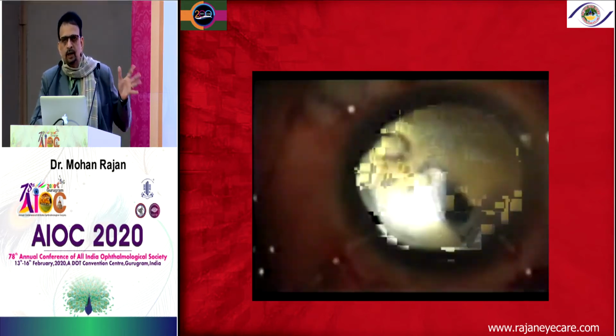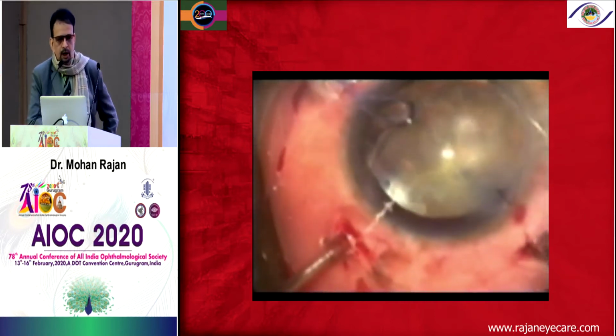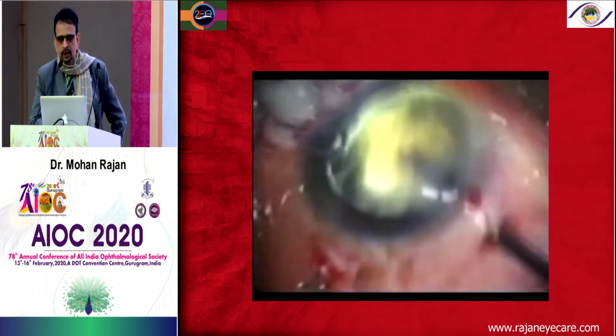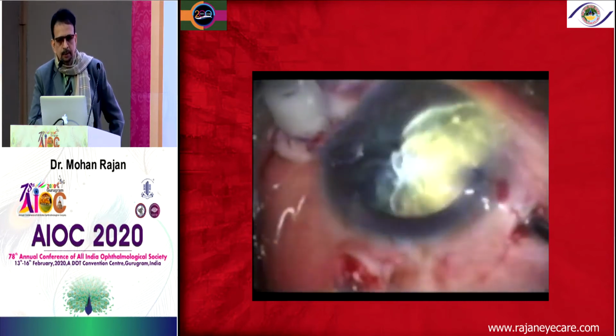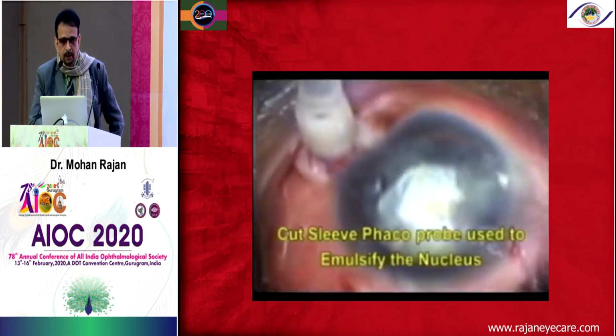If you are not trained in vitreoretinal surgery, don't try to do it, because this is the 3-port sclerotomy you do. Nowadays you can do sutureless, 23 gauge, 25 gauge you can use for that matter. The 23 gauge fragmatomes are also available.